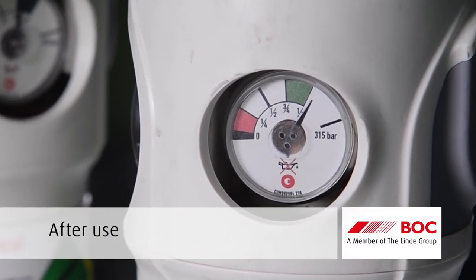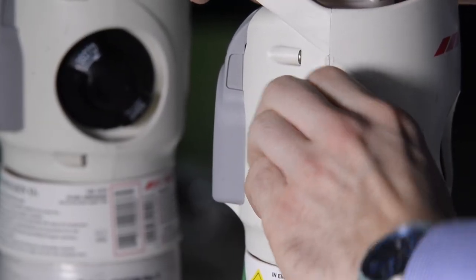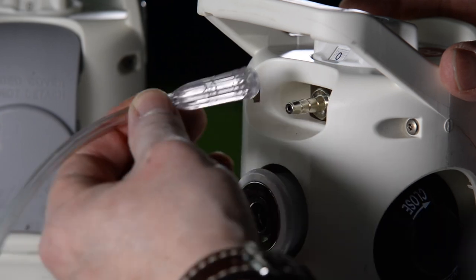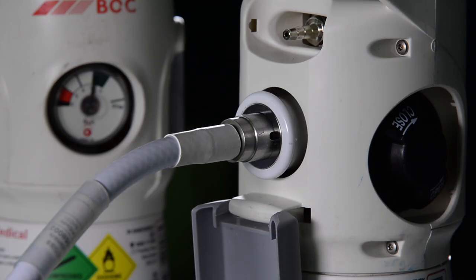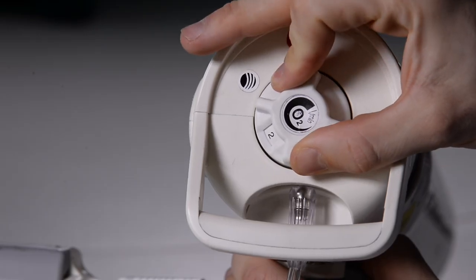Remove the mask or nasal cannula from the patient. Turn off the cylinder by rotating the hand wheel clockwise until it comes to a stop. Remove the tubing by firmly pulling the tube whilst holding the cylinder handle. Release the probe by twisting the capstan clockwise or by pressing the outer circle of a quick connector. Turn the flow selector to zero.